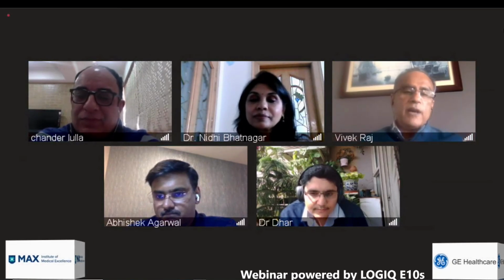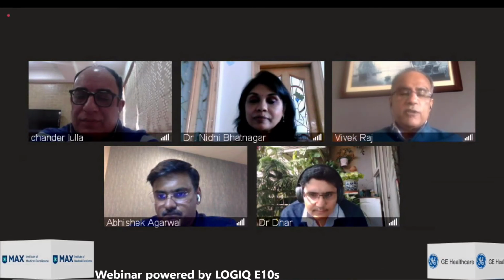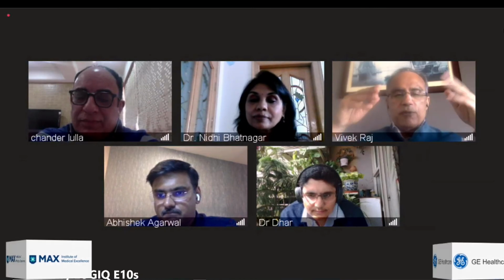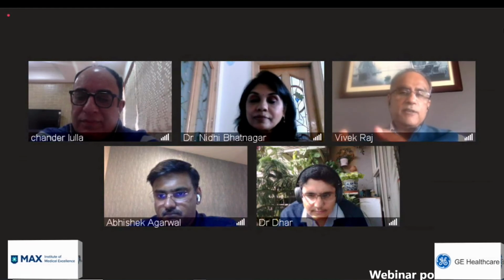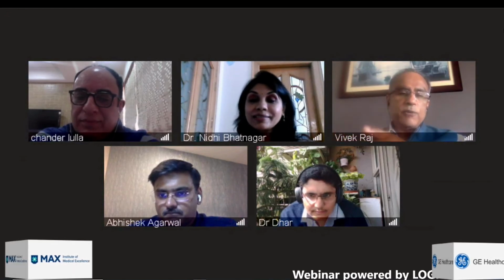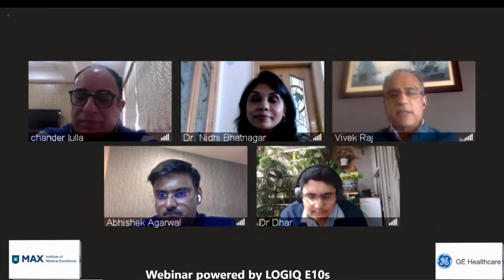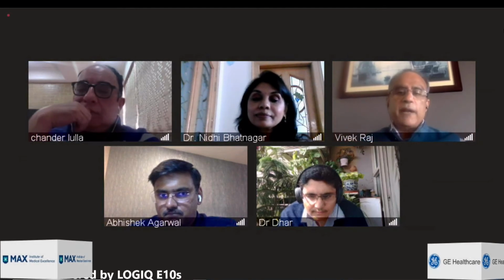So, for example, in our hospital, the vendor that we have been working with, we had 2 or 3 vendors initially who came in, and we went through the whole process of screening them. We asked how many cases their technician has done, and which technician is going to come. We don't want three technicians coming on 3 different days. And how often are they calibrating and recalibrating the machines? So I think that is important. As I said, quality matters.